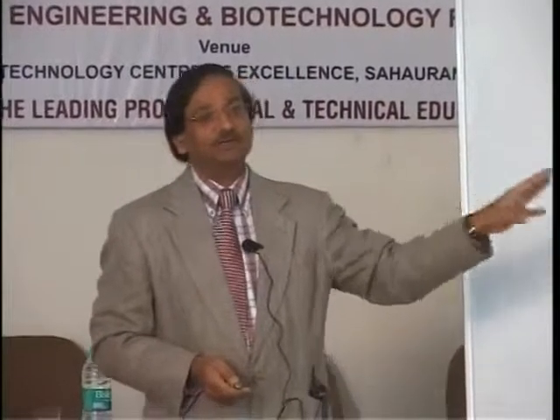So in a given situation, you couple the anatomic information you are getting from CT and MR with the physiological information you are getting from, say, PET-CT. When fused, a single image gives you two kinds of information: an anatomical one, where the abnormality is located, as well as how this tissue is behaving, whether it is a vascular tissue, a malignant tissue, a cancerous tissue.